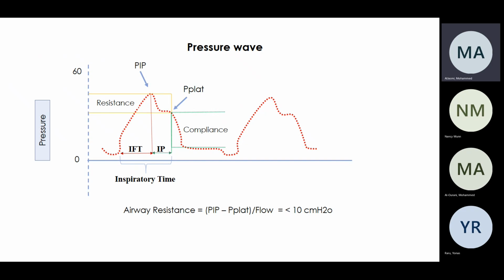Okay, good, awesome. At least better than last time you were here, guys. I asked, what's the normal compliance? And it was, oh, 13, 15, 20. So good, more than 60. We say it's okay, but normally in us we say 100, 120 is a normal compliance in a normal person. But more than 60, we'll say that's a normal compliance.